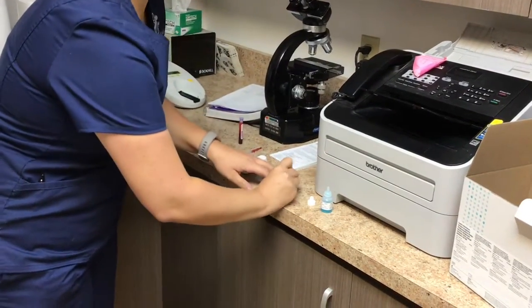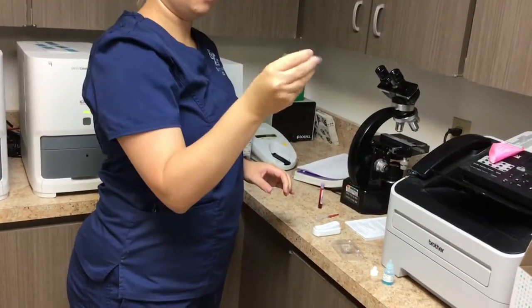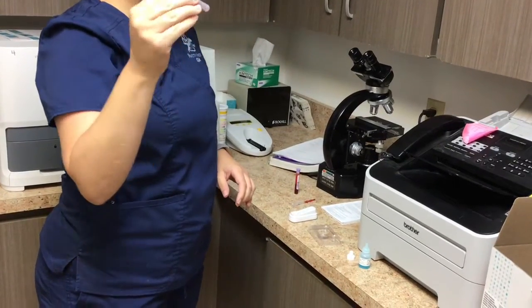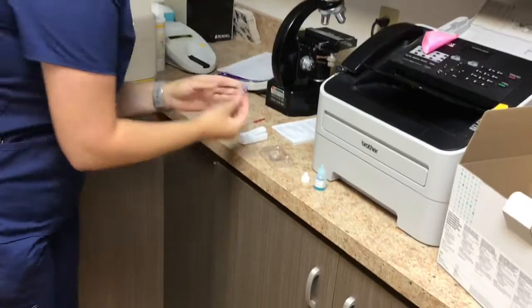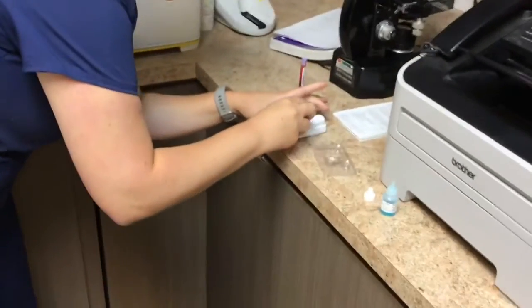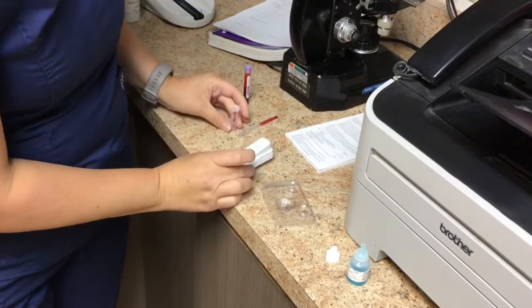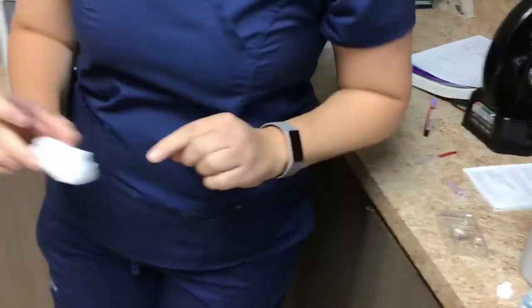I'm going to cap it and invert it to mix a few times. And then I'm going to go ahead and place this in my snap test. And then allow time for that to start to move throughout the snap.